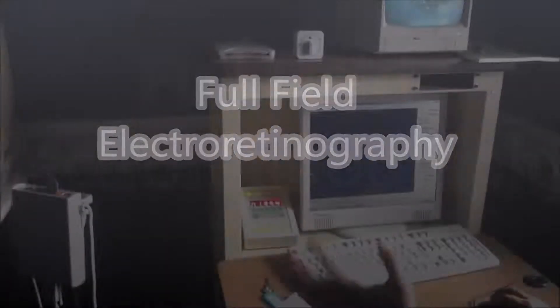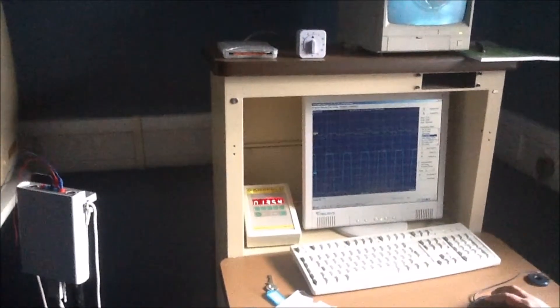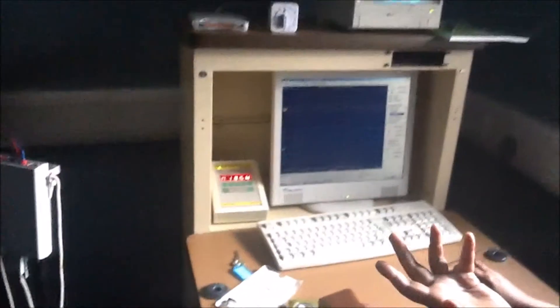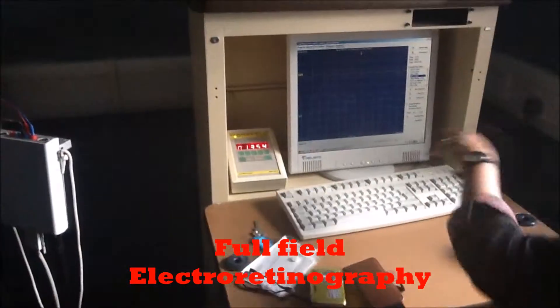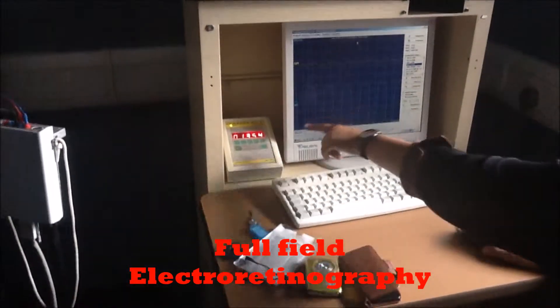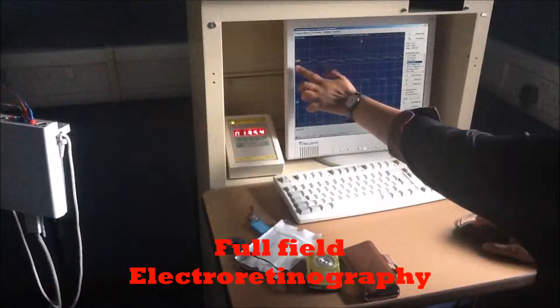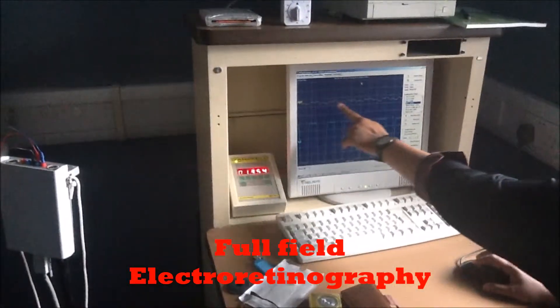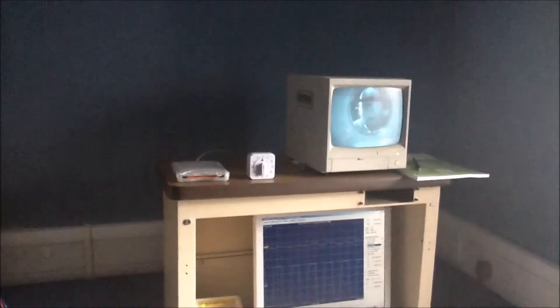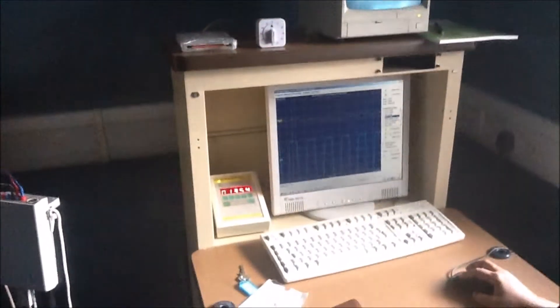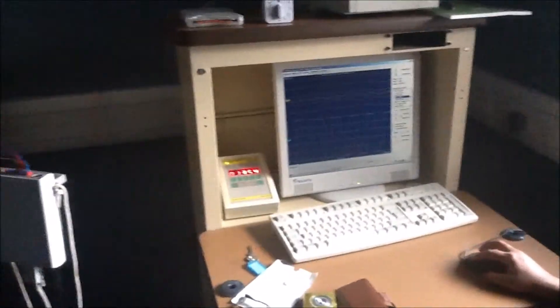We do both eyes actually — you don't need to cover. Since his left eye is not the test eye, that's why the channel is like that. You can see the signal coming in on the right channel because that's the one we are testing. You can see his eyes — this is a flicker light. Ready, Ras?